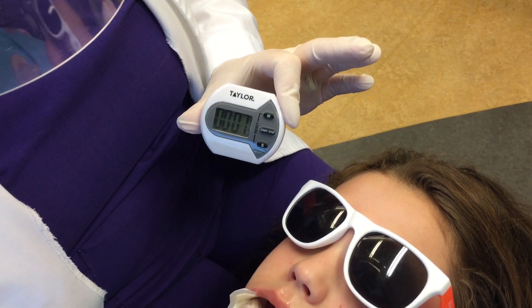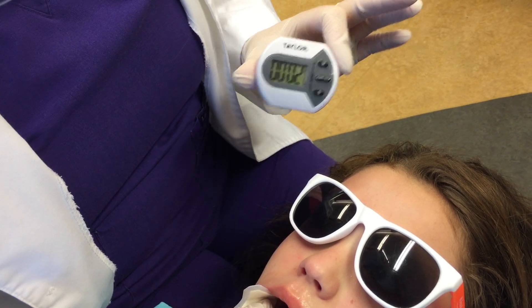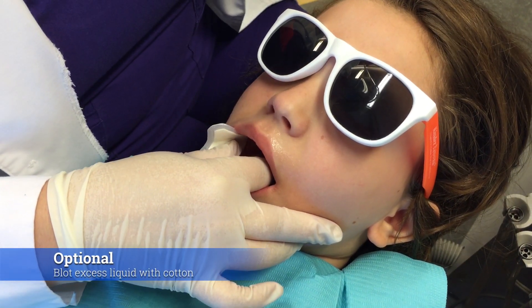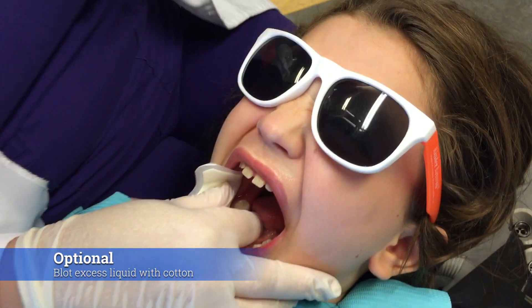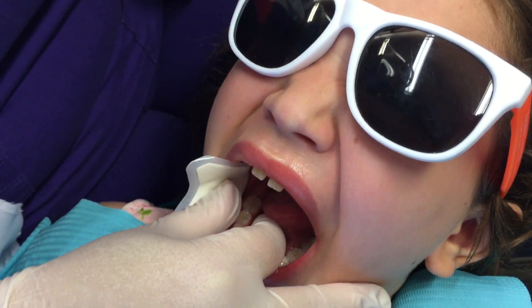Just a few more seconds left. There's nothing else you need to do. If there is some excess pooling on the top, you could blot the excess with some cotton — just blot excess and that's all you have to do.